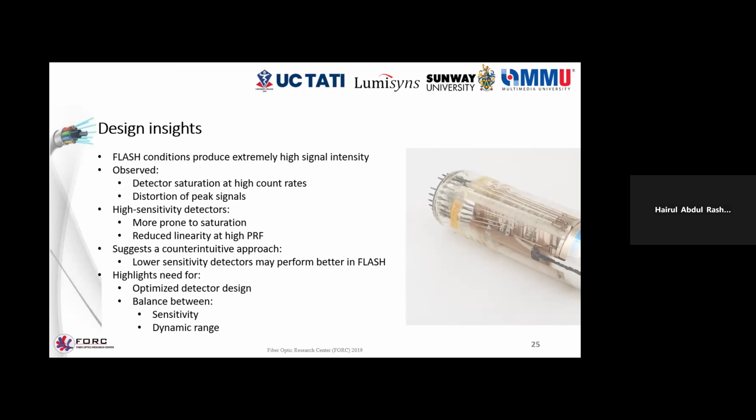So perhaps it is time to look at new or other earlier, less sensitive detectors which may be suited for FLASH application. And trying to balance the two, we need to find an optimized detector that provides a balance between sensitivity and dynamic range.